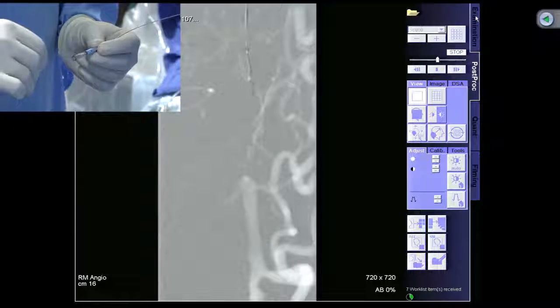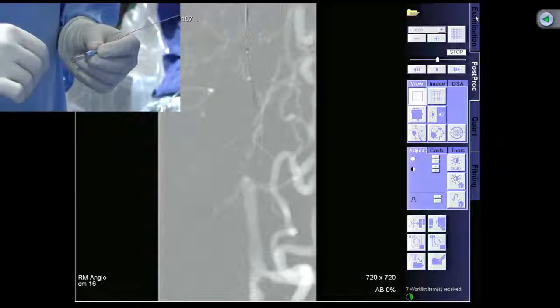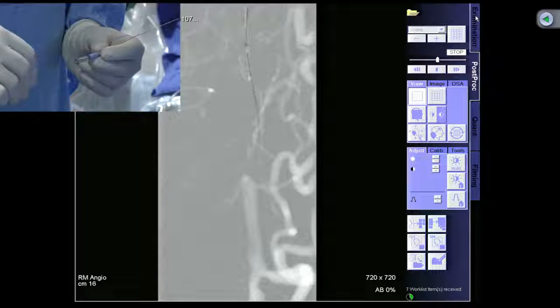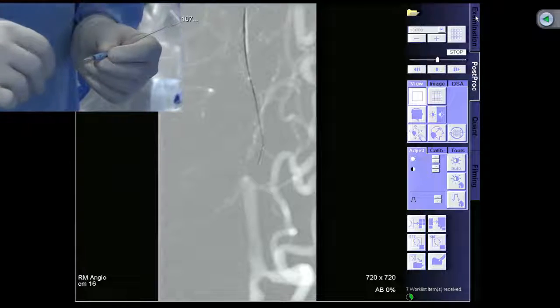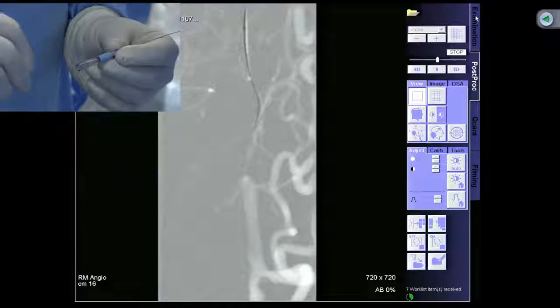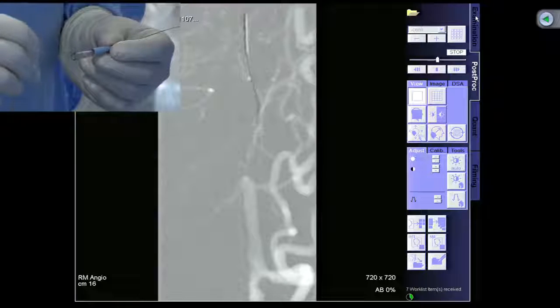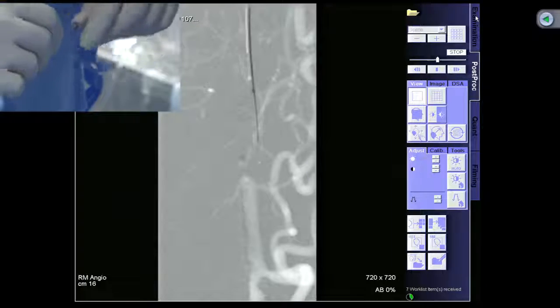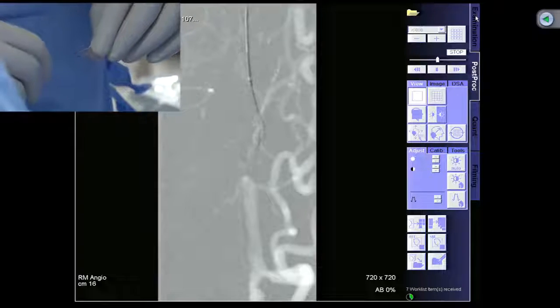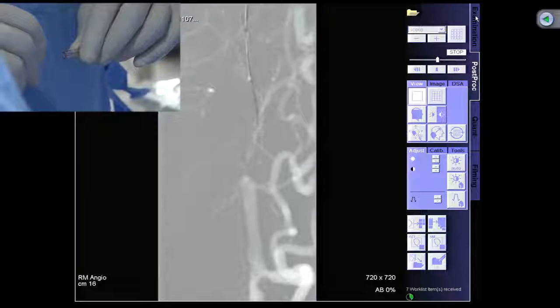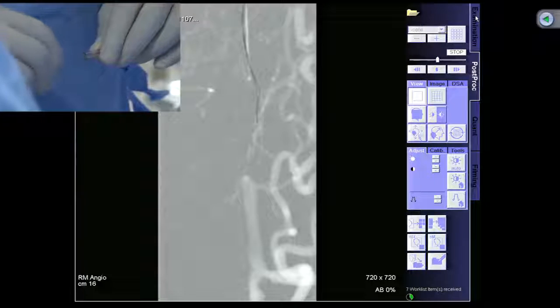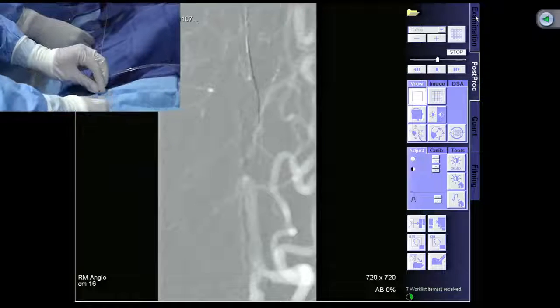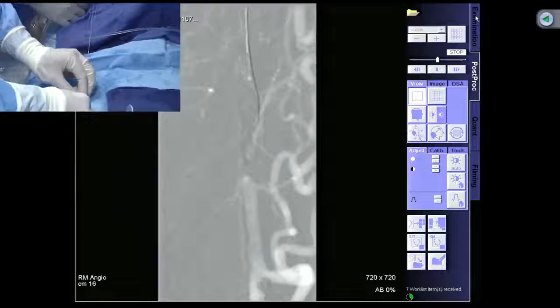We're clearly in a different plane, so we'll likely need a re-entry device. Dr. Wiley asks about re-entry device preference — I think ultrasound guidance is very helpful to really see which way to go. Since the Viance device has failed here, we're going to proceed with our usual techniques. We've created a subintimal plane, so now we're changing strategy. I'll have Dr. Guja walk the device out and we'll switch to a 0.035 system with a directional catheter.